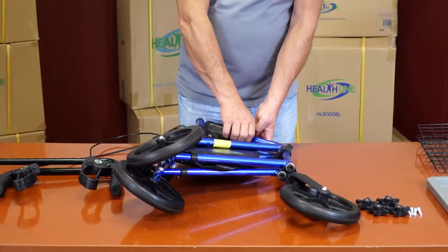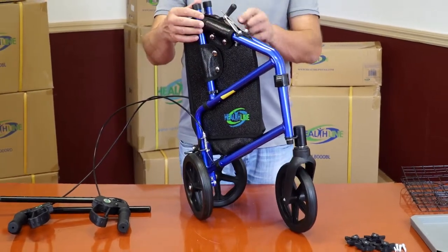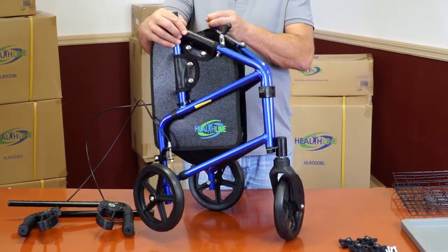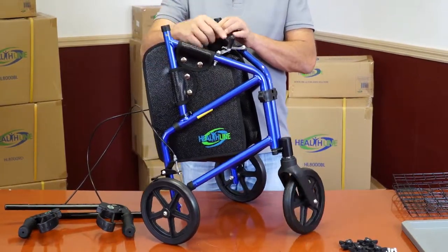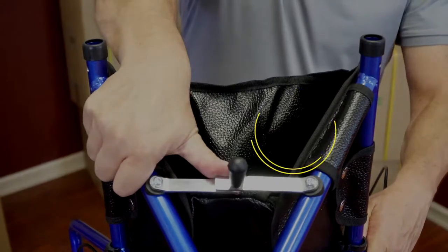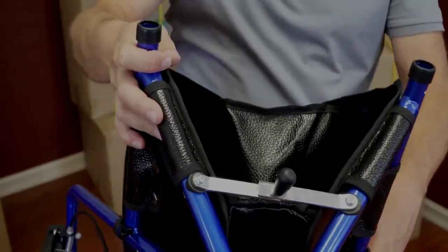Assemble the main Rollator frame. Set the main Rollator frame assembly upright and spread the sides apart. Push the spring-loaded security lock on top of the frame all the way out, making sure it clicks into place. This will prevent the frame from accidentally folding onto itself.